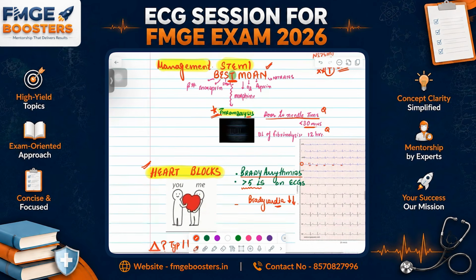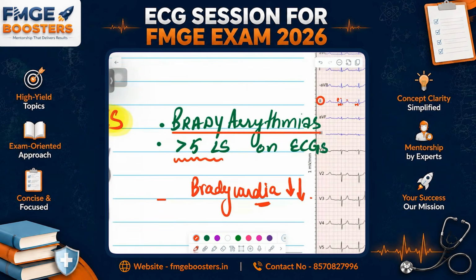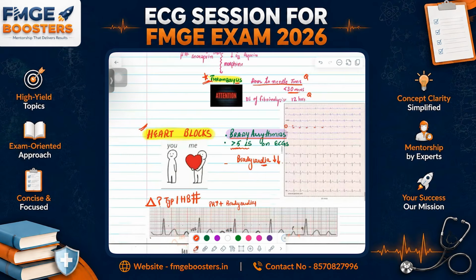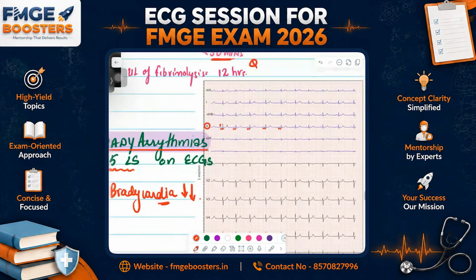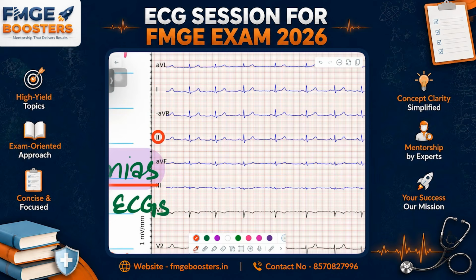Okay. Now let's talk about heart blocks, which you all think is the toughest topic. And we are starting with the topic of bradyarrhythmia. Brady means what? More than 5 large squares on ECG. Okay, guys? Now let's look here. This is a normal ECG. Just see, this is a normal ECG, right? Can you appreciate PQRST, PQRST, the QRS complex, right?